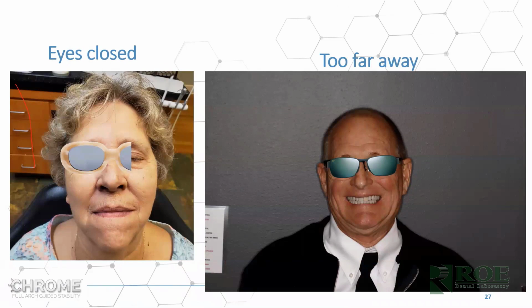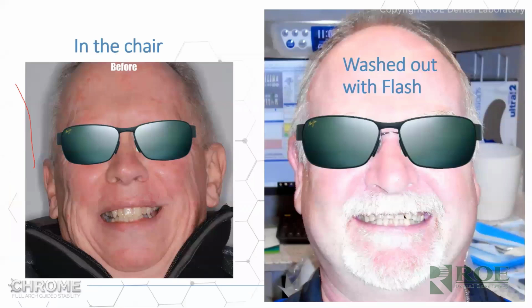One thing about photographs is we want very good photos to do a smile simulation. So obviously we want to see a smile, want to see teeth, I want to see the eyes open. Try not to take one like the one on the right. Try to bring the camera a little bit closer, because by the time you zoom in on this gentleman, it'll be fuzzy. It'll be a little bit out of focus.